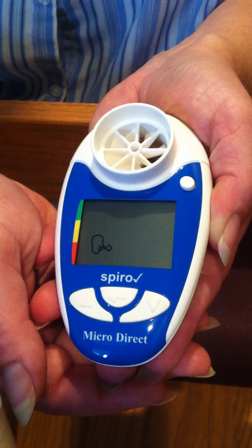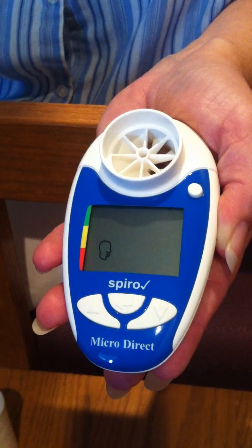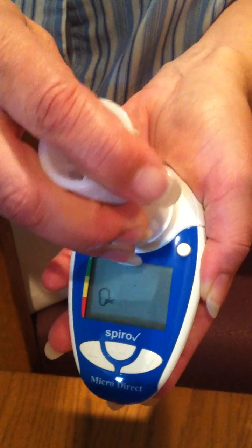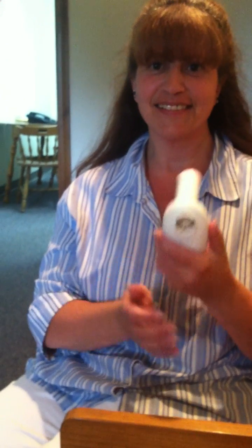Once you enter the person's ethnic origin, you will see a blow icon appear on the screen. Now you are ready to insert the disposable mouthpiece and the SpiroCheck Spirometer is ready to use. Make sure not to cover the vent hole when using the SpiroCheck Spirometer.